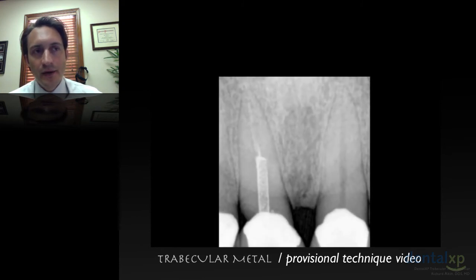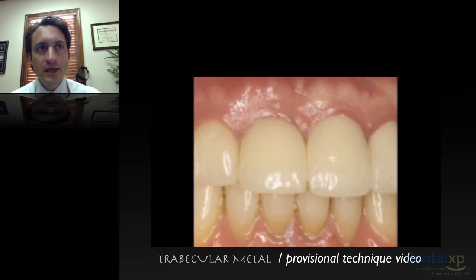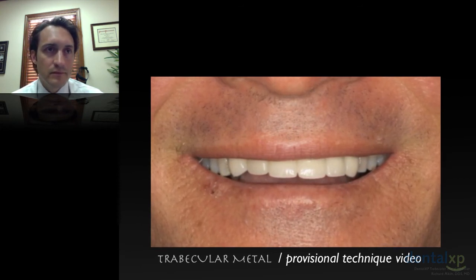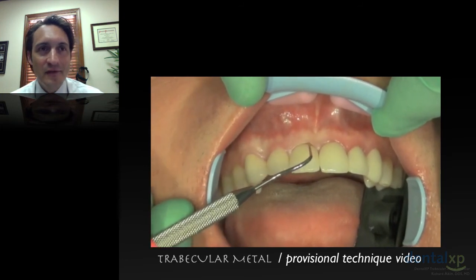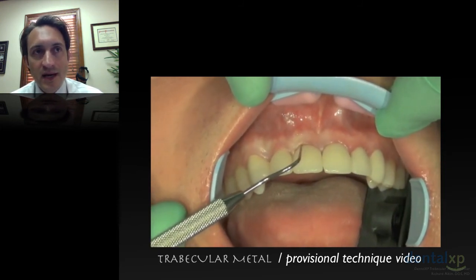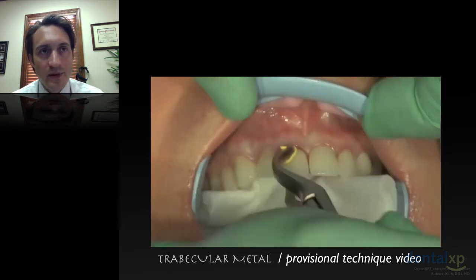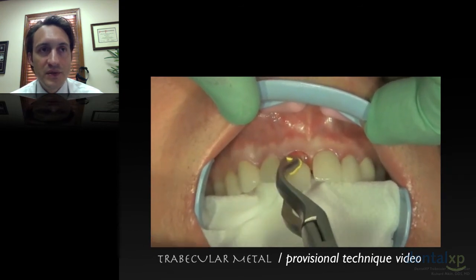Patient had marginal failure around this crown. Here is the initial presentation and the marginal gingiva, as well as the smile. Low smile line is always nice. I always get a lot of information from probing, and once the patient's anesthetized, we can probe much better than we can at the preoperative appointment. If there's any question about buccal plate thickness, I will get a cone beam. The buccal plate was in a very favorable position.